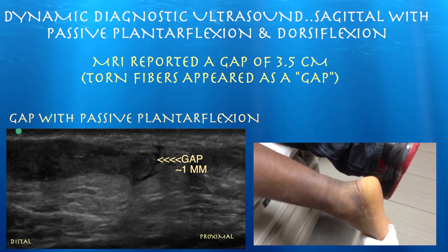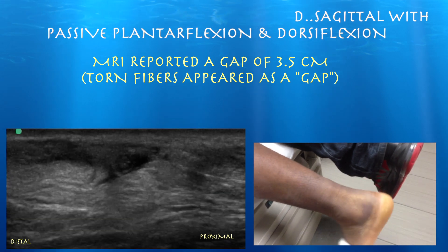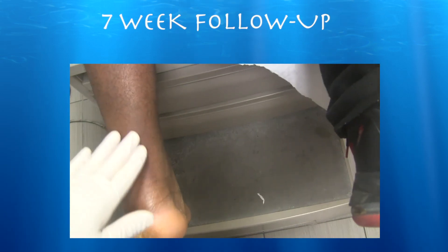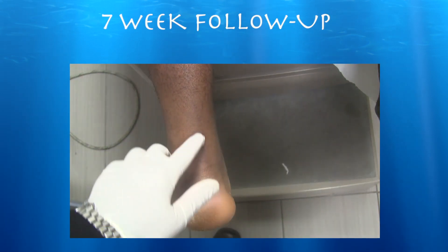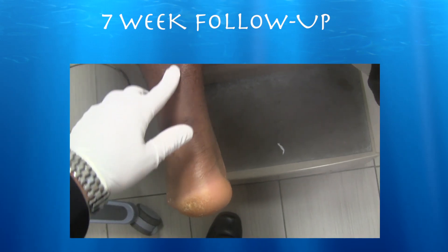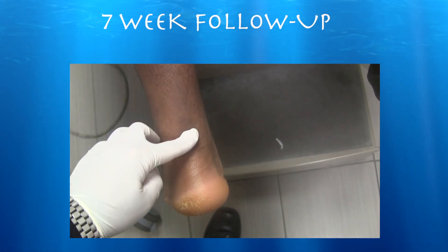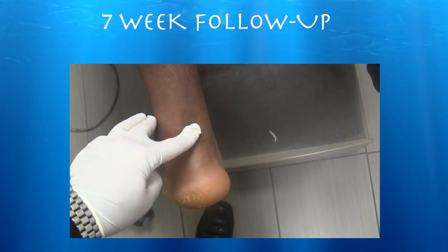If we just went by MRI, we may have been more inclined to treat him operatively. Seven weeks into the Achilles injury, he's been wearing a rocker bottom Achilles boot, full weight bearing, and going to physical therapy for the past three weeks — and he's feeling better.